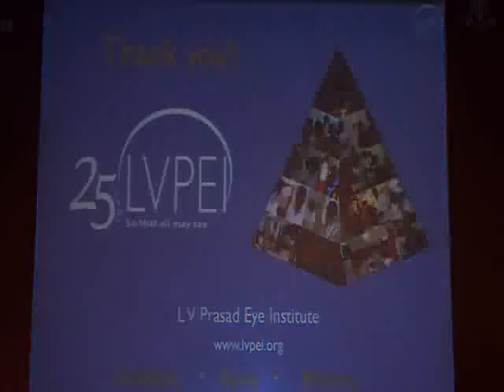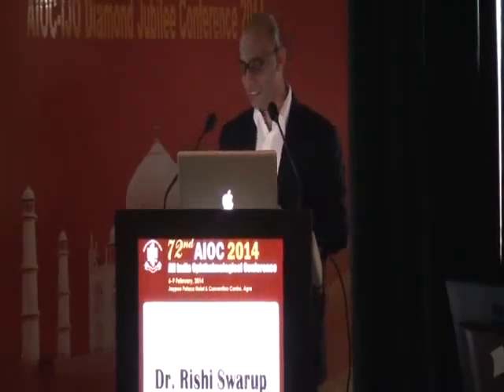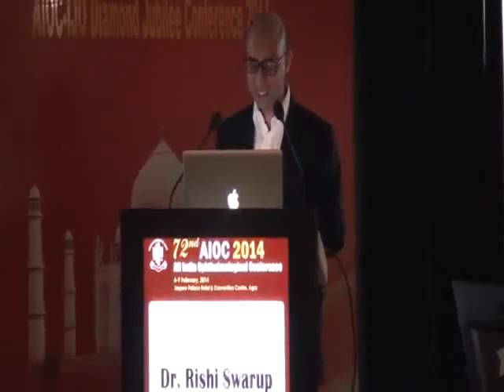So we are moving backwards, so now we finally come to Rishi's presentation on manual techniques of anterior lamellar keratoplasty. Okay, so I'm sorry I had to do this last, but my file got corrupted and I had to redo the whole presentation while I was sitting.